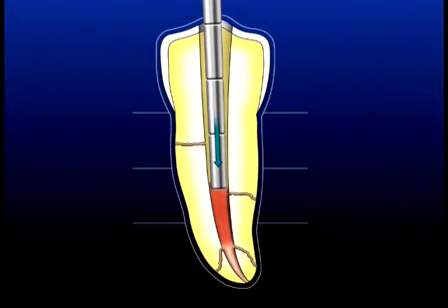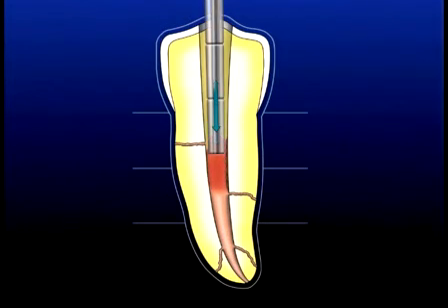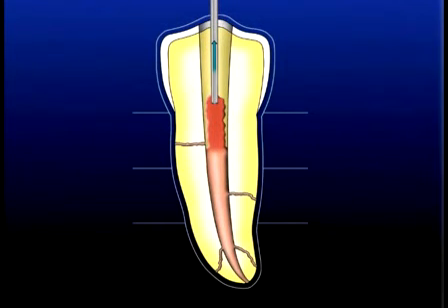This molds the gutta-percha into the shape of the canal and, importantly, offsets shrinkage during cooling. Through a series of gutta-percha injections and vertical condensations, the canal is filled in a reverse manner. The clinician can abort the backpack at any level desired based on prosthetic considerations.